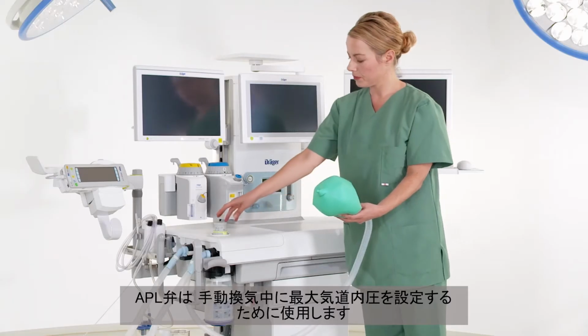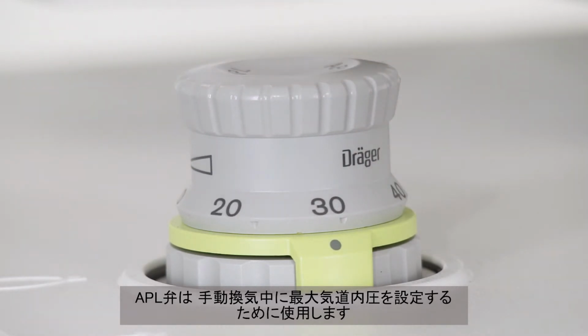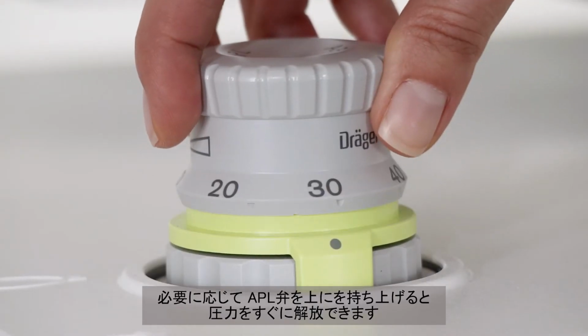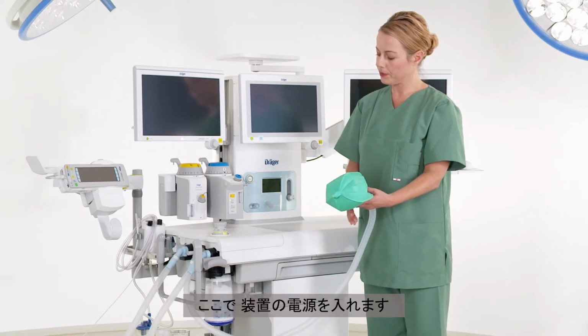The APL valve is used to set the maximum airway pressure during manual ventilation. If required, lift the APL valve head for rapidly releasing pressure. Finally, turn on the device.